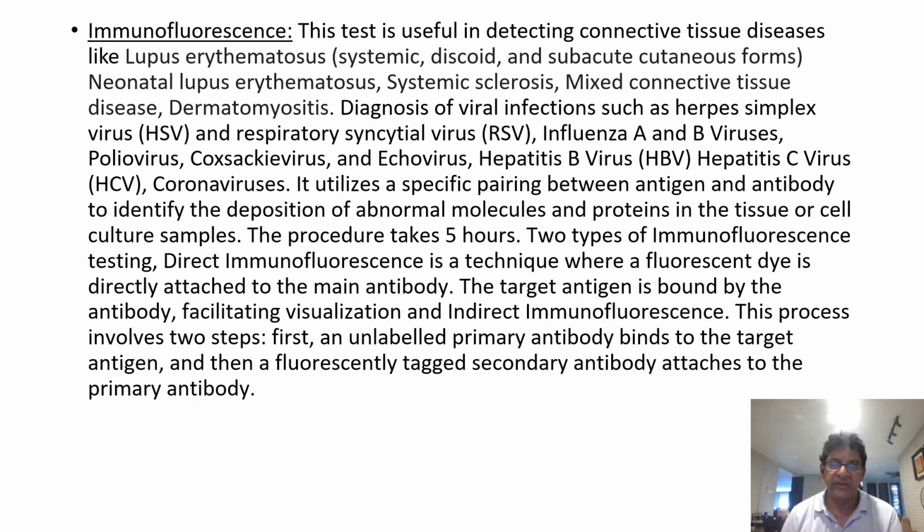Immunofluorescence is the next test. This test is useful in detecting connective tissue diseases such as lupus erythematosus, systemic, discoid, and subacute cutaneous forms, neonatal lupus erythematosus, systemic sclerosis, and mixed connective tissue diseases like dermatomyositis.